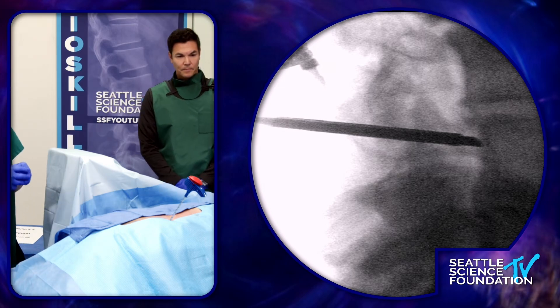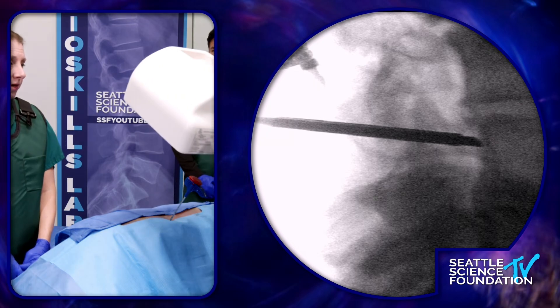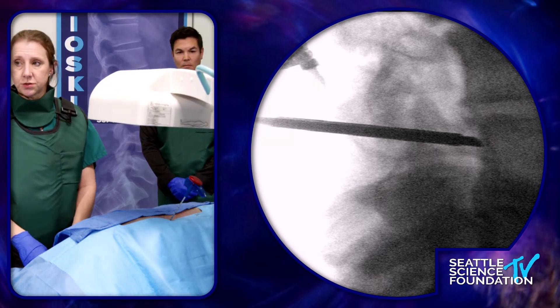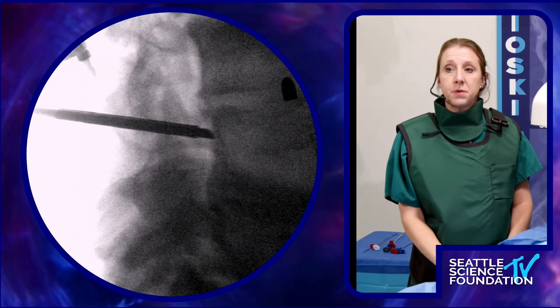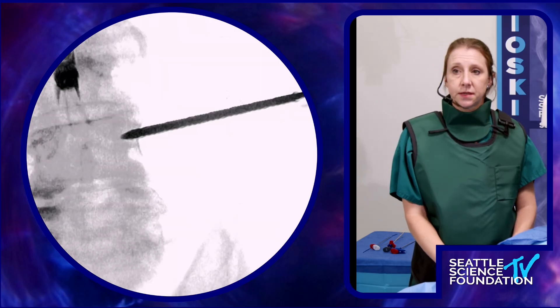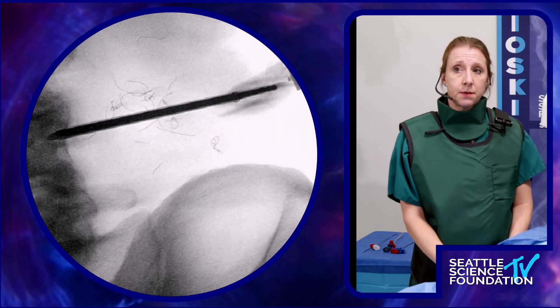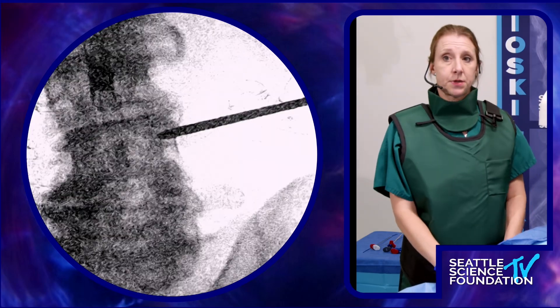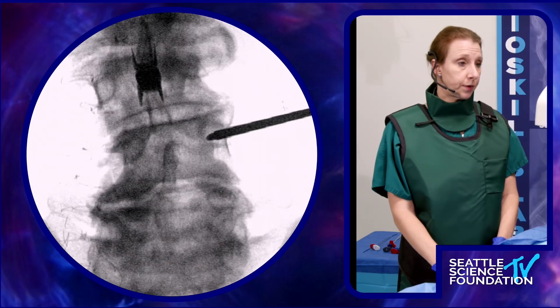I'd like to see how this is progressing in an AP position. The considerations here are making sure that you keep the introducer cannula within the pedicle and not crossing medial to it, where you could enter the central canal or cause a radiculitis. I can see here this is looking really good — the bevel tip is not medial to the pedicular border.